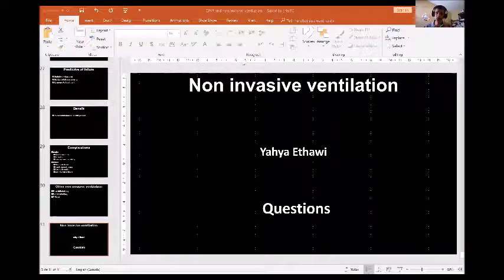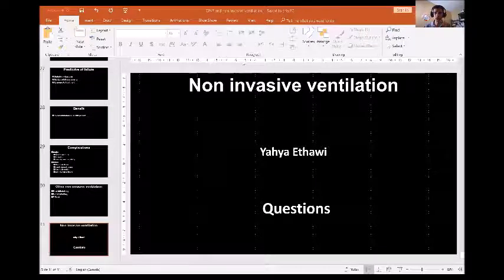And that's why these machines are cheap. These can deliver different types of pressure. It can stop at any time. It's difficult to regulate, and it should not be used. The only CPAP used for pediatrics is through a pressure from a central source, medical air and oxygen, and then a blender. Either the machine blends it, or you should have an air oxygen blender. Never ever use it in pediatrics.